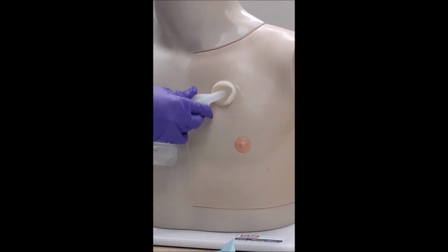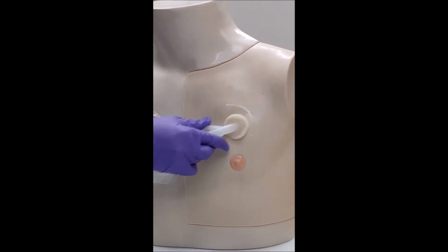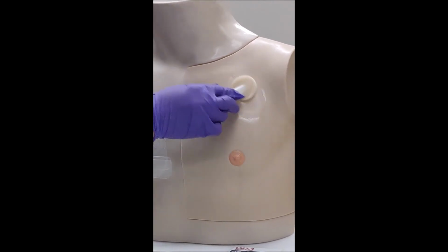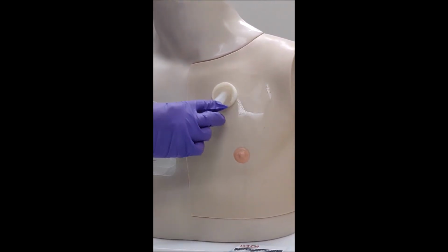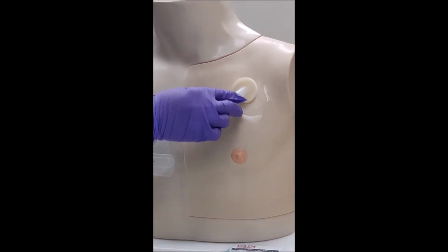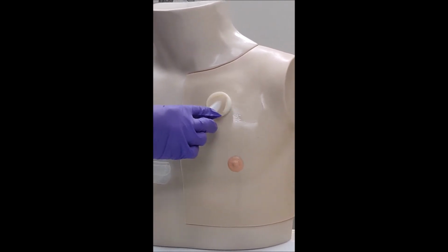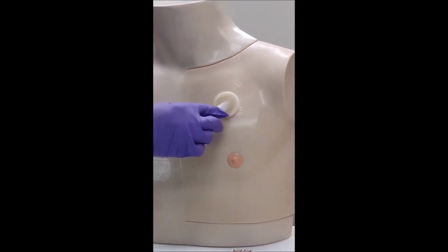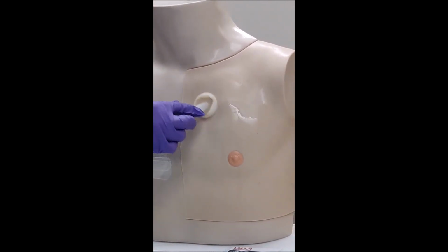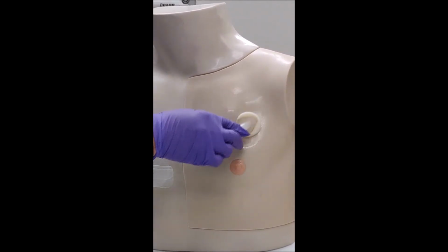And so then we would clean the area, again, at least 30 seconds, and you want to make sure that it's clean. As you're cleaning, you want to start inspecting the area. You want to make sure if there's any hematoma, is there any irritation, anything that looks abnormal to you. You want to also make sure with the patient, hey, Mr. Chester, do you usually have trouble accessing your portacath? Is it easy to draw blood? Just gives you an idea on the potential challenge you may face when you're entering the needle.